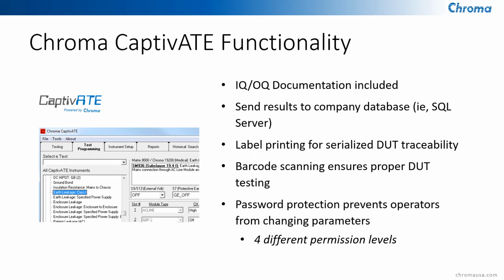More or less what that is, you could have a pre-designed barcode, and once you scan it, all of the appropriate test parameters will pull up based on the type of product you're testing.